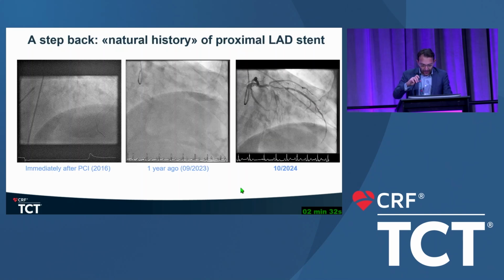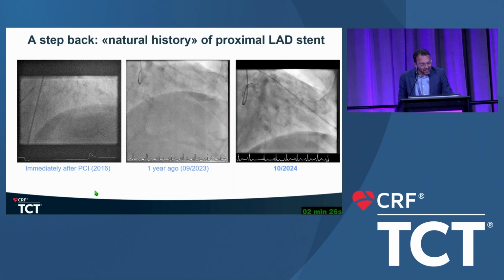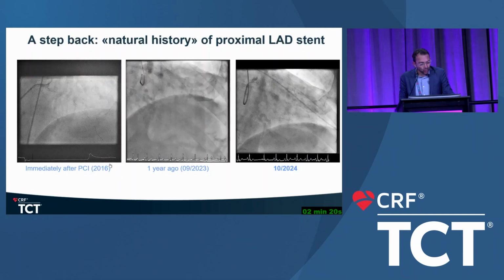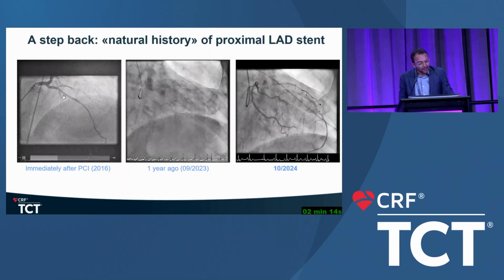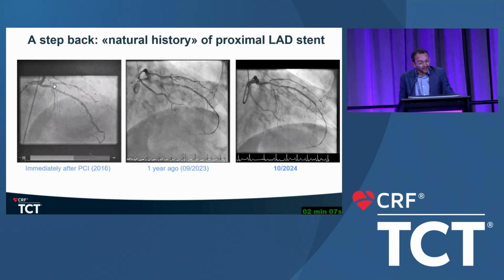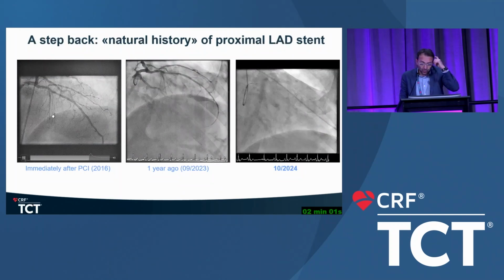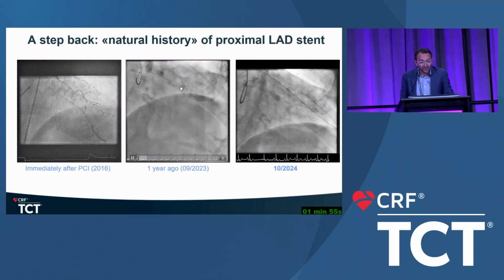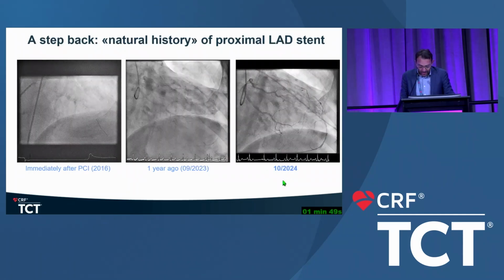So how shall we now tackle this patient with 2 new lesions in the 2 vessels which were previously treated? This is just to bring up the discussion we already started. This was the procedure last time we saw it in 2016 at the end of the procedure. You see that the result is relatively okay-ish at that moment. The patient got a second stent implanted in the mid-LAD, and for the first time a stent implanted in the diagonal branch. There was some disease proximal involving this bifurcation, which was left untreated. Perhaps that was at that moment a good strategy, because 1 year before, in 2023, the lesion, angiographically speaking, was, I would say, very similar, whereas it clearly deteriorated 1 year afterwards.